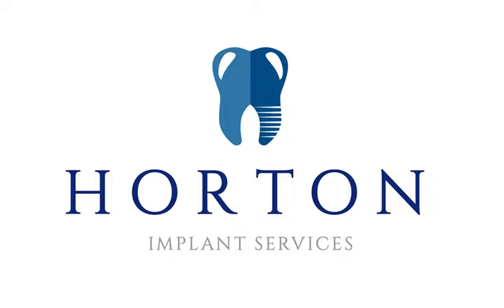And then on the other end of the spectrum, we've got the really soft bone, very, very soft, like polystyrene. Placing an implant in that and getting stability can sometimes be a little bit difficult. So we may determine to leave the implant in that type of bone for a longer period of time than we would if we had, for instance, type 2 or type 3 bone, call it medium density bone.